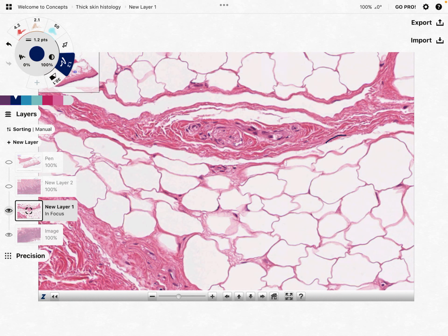All right. So with the hypodermis layer, a lot of different things can be seen in here. There are obviously large blood vessels, connective tissue, nerve cells, etc. But for me, what really stands out is the fact that we see adipose cells. And adipose cells, I always liken them to soap bubbles. If you were to see soap bubbles forming in a bubble bath, for example, you often see them growing and they get really large, these open spaces. They look like soap bubbles in my opinion. I don't know if that's helpful or not, but that's one way I can determine whether I'm looking at an adipose cell. So the big predominant feature of the hypodermis is the fact that we have all this adipose tissue with these adipose cells.